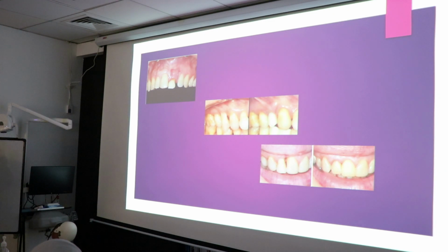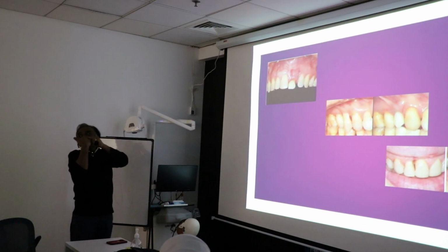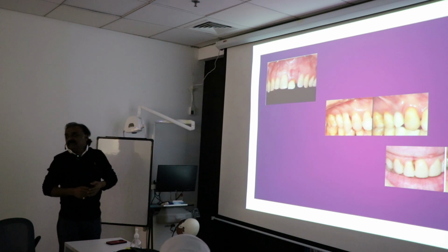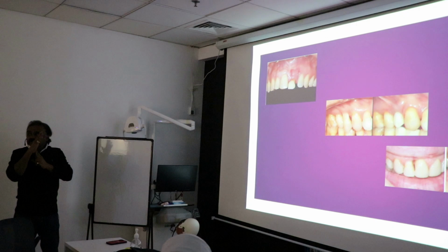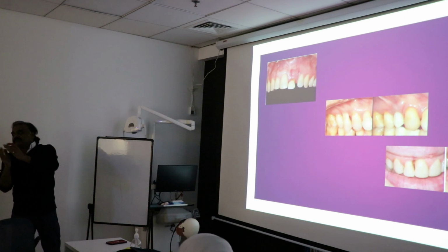Yeah, the anterior incisor is always like that, right? So what we are trying to do is this. We are bringing it down, we are giving the buccal torque here. This way. Oh, the root is palatally torqued. Okay, sorry. So when you do that, there's a tension here and bone starts to form here. Even for an angular defect in the premolar region, it is possible. When we start to tip it and when we start to move it towards the defect, bone starts to form here as such.